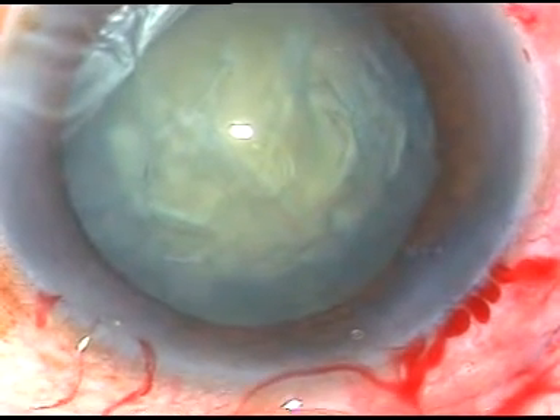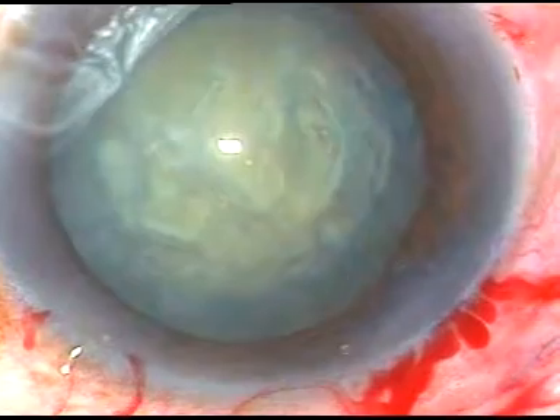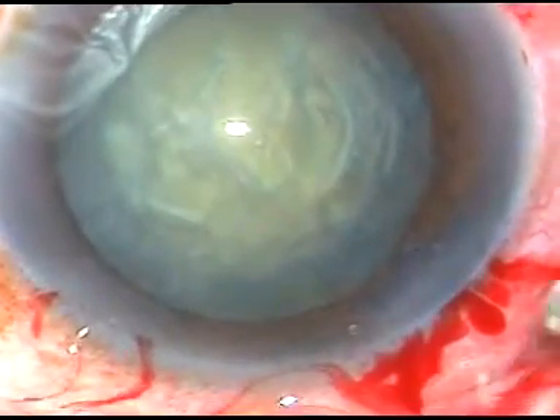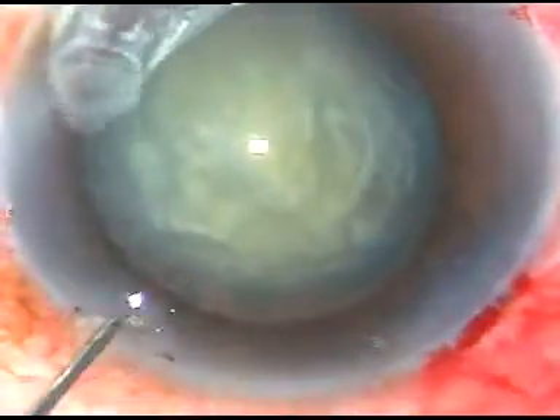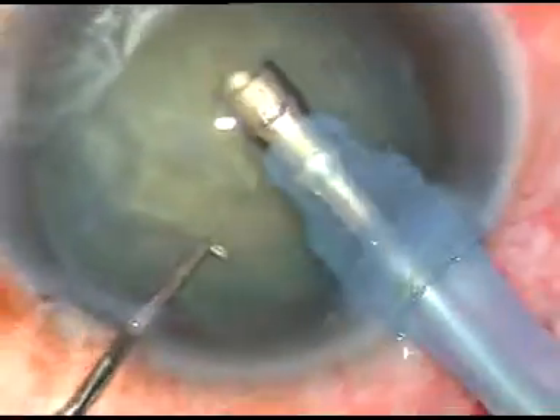Now, the viscoelastic substance has been injected again. Now is the time to enter into the eye. The tip of the FACO handpiece is introduced. The machine being used is the Oertly Caterex 3 FACO machine.